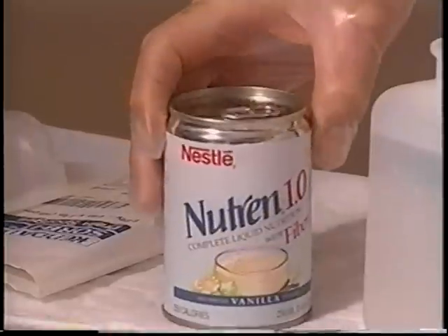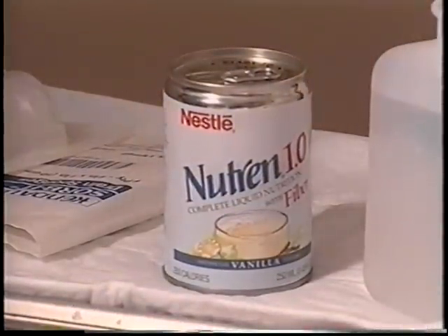If the patient has a tendency to develop nausea and vomiting, that would be one of the scenarios where you would ask the patient to potentially move maybe from a bolus feeding to a continuous feeding over several hours. Sometimes it's the quantity of the feeding that may be causing them to be nauseated. They might try different types of feeding products. They might try something that's diluted with a little more water, and kind of troubleshoot what could be causing the nausea. You may want to make sure that the feeding substance is at room temperature and is comfortable for it to be placed into the stomach.